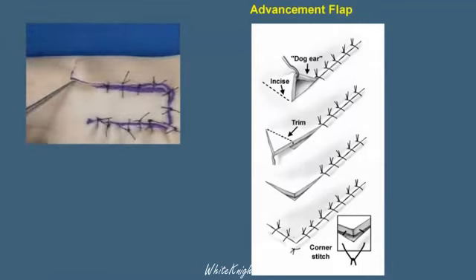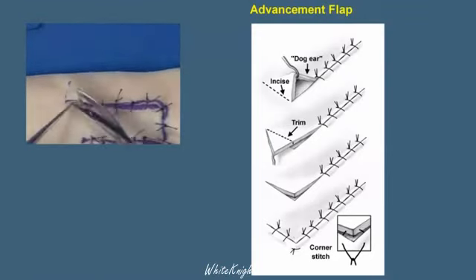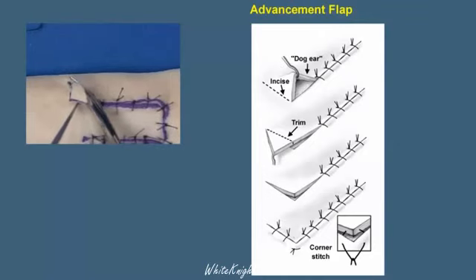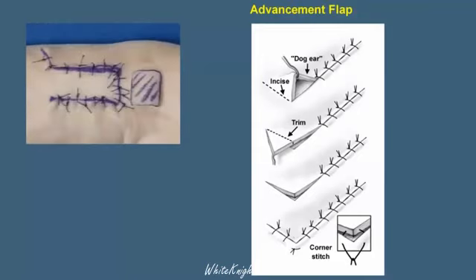Undermining is done under this dog ear deformity. The skin is transposed back until one can exactly see how much skin is needed to be trimmed. The skin is then trimmed, and the flap is inset. This flap is then sutured into place, and the dog ear deformity is resolved.